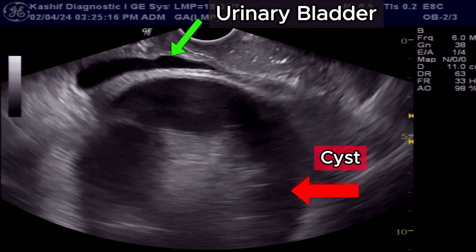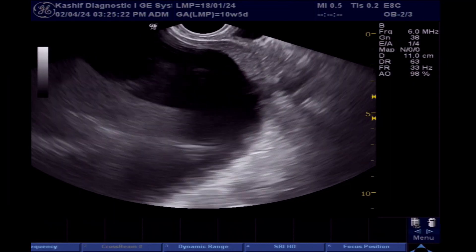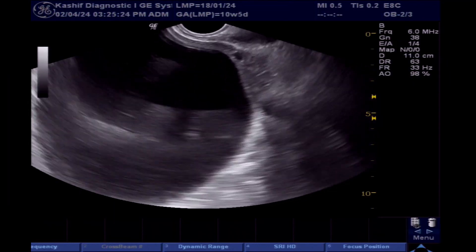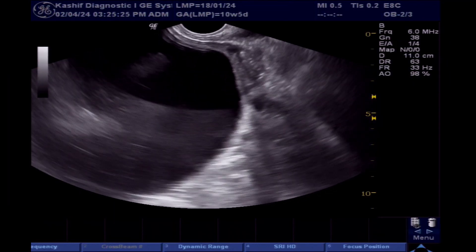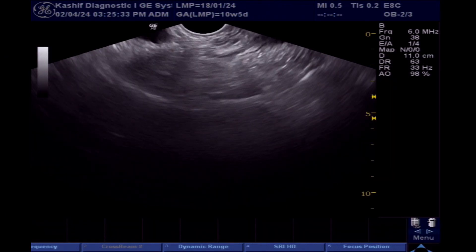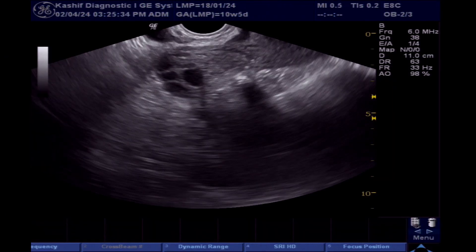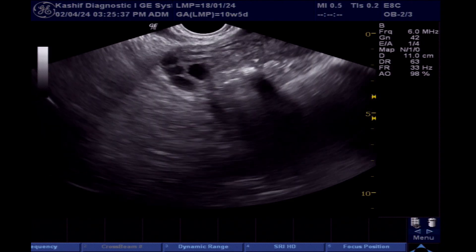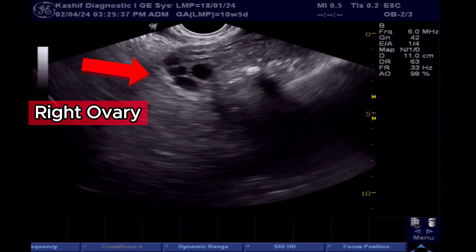However, TVS clearly differentiates the cyst from the urinary bladder. TVS also clearly visualizes the ovaries and shows that the cyst originates from the left ovary. The right ovary is also visualized and is normal.